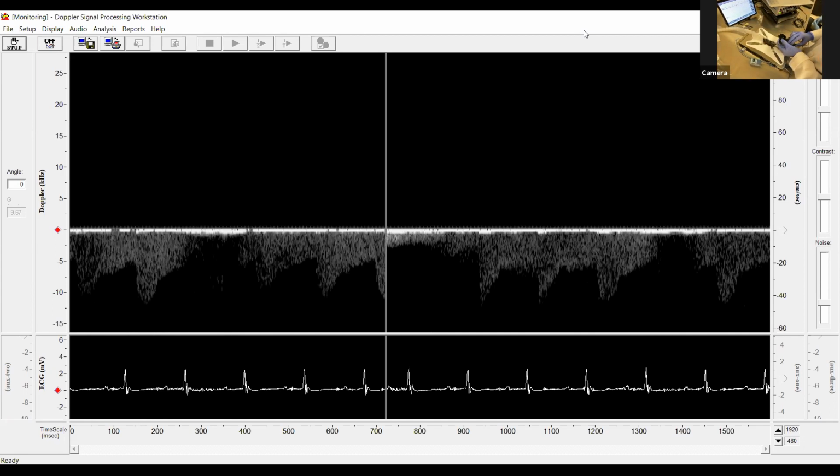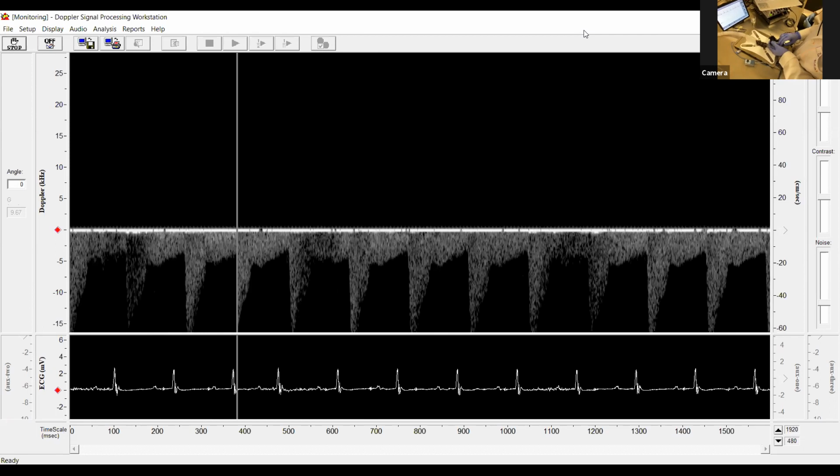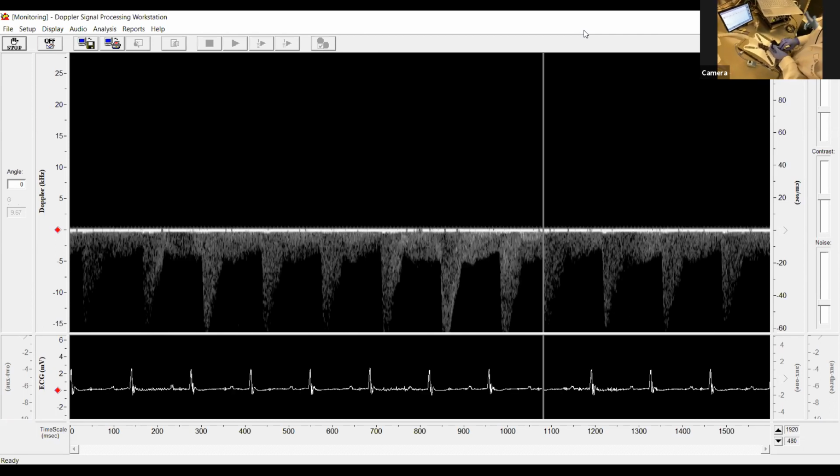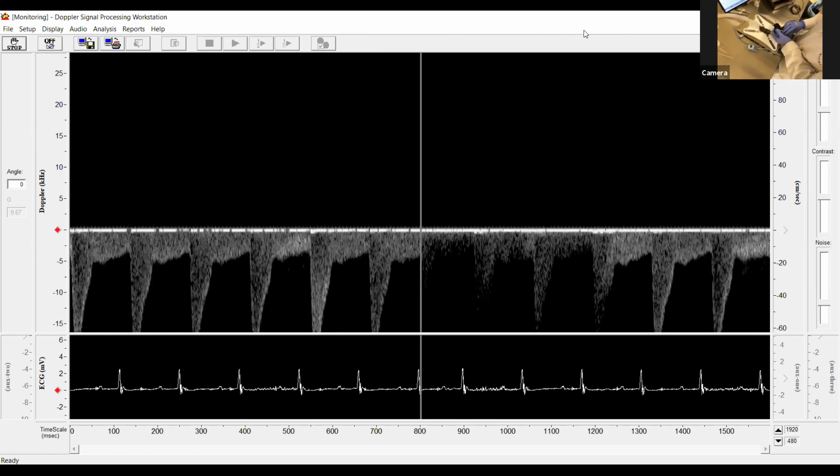That's venous flow. So it's non-pulsatile, but there's still a velocity associated with that, where a small movement over, going from the vena cava to the aorta, is a small shift, but it's a very different waveform that we're looking at.